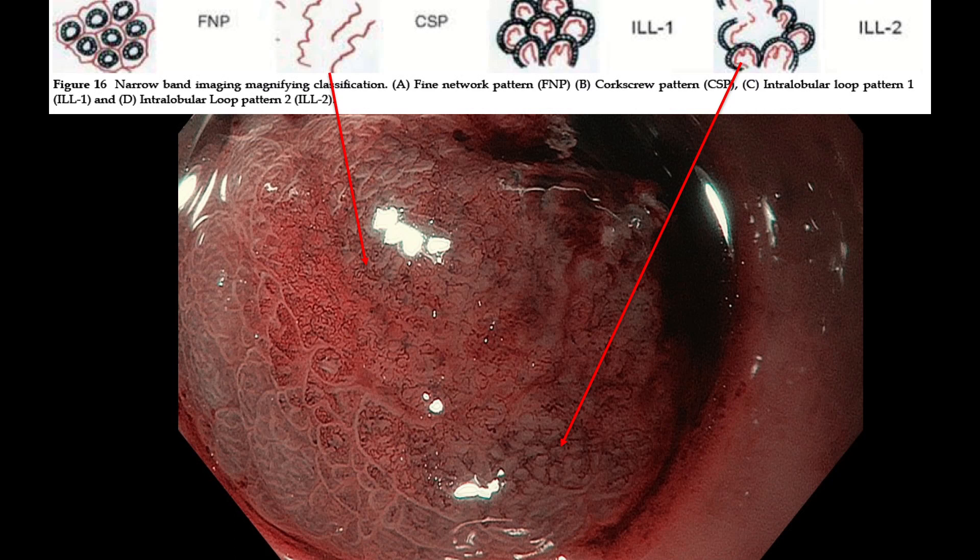For undifferentiated cancer, the resection margin is very important. What is your approach? How far do you resect from the center of the changes? I usually keep at least three millimeters away from the actual target lesion to the marking, then cut outside the marking dot. That means we can usually keep at least five millimeters of free margin from the tumor.